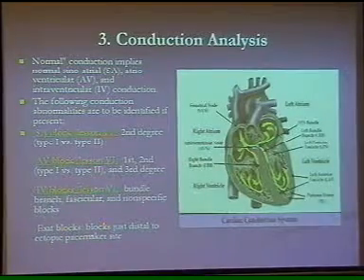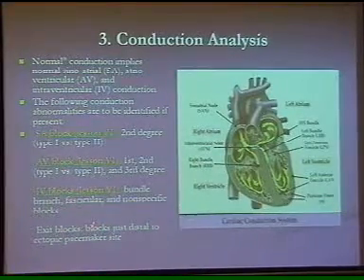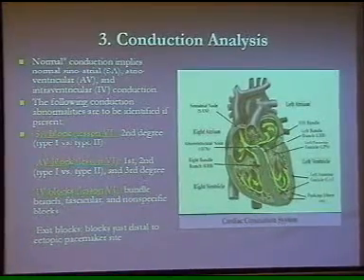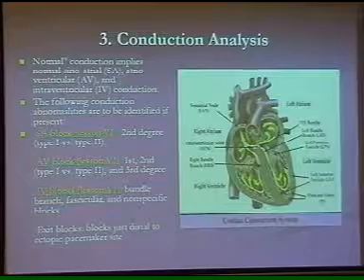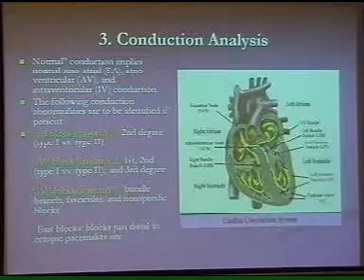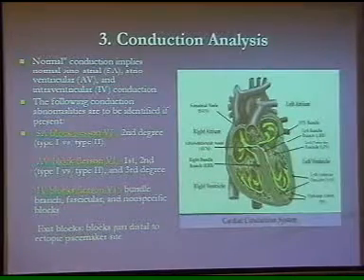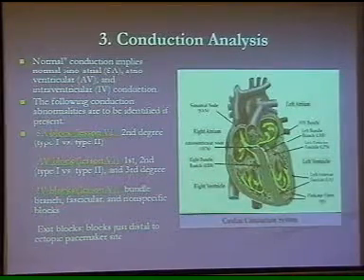Exit blocks are blocks just distal to the ectopic pacemaker site. Very simple: although the impulse is being generated, it is not spread out. So there's a block at that point. It could be due to different disease conditions, but that's called exit block.